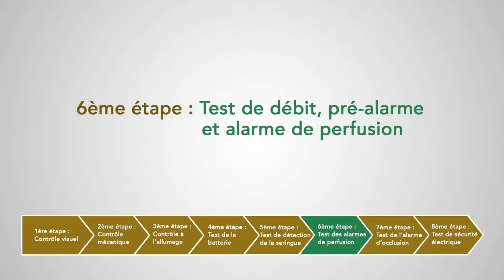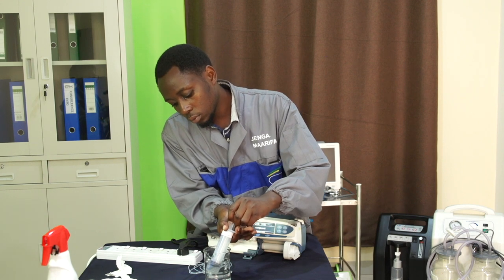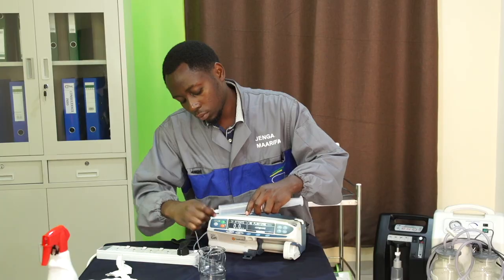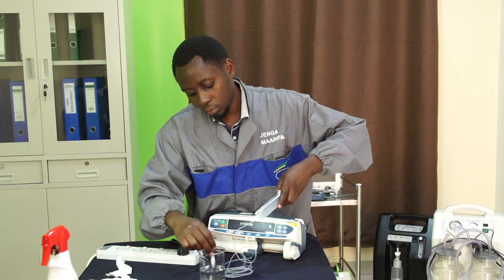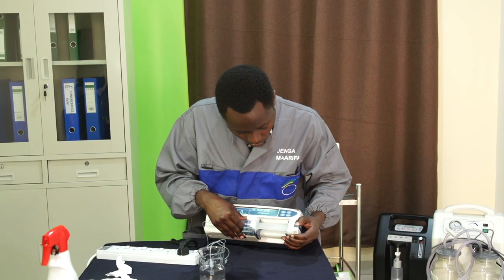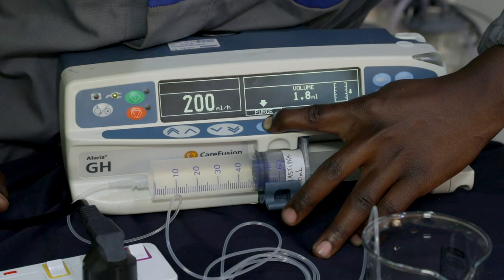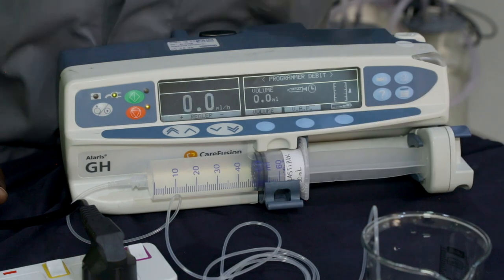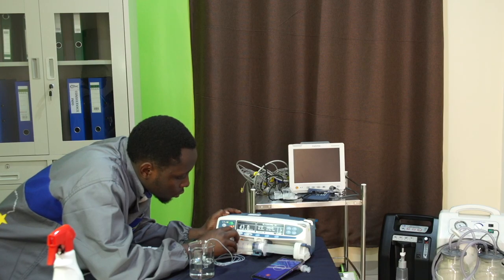Sixième étape : test de débit, pré-alarme et alarme de fin de perfusion. On va remplir d'eau une seringue de 50 ml, connecter le prolongateur à la seringue et éliminer les bulles d'air. On insère la seringue sur le pousse-seringue. À l'aide du bouton adéquat, on va purger la ligne jusqu'à avoir précisément un volume de 50 ml d'eau dans la seringue. On va régler le débit des perfusions à 50 ml par heure.